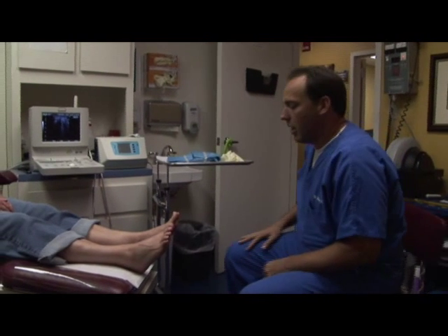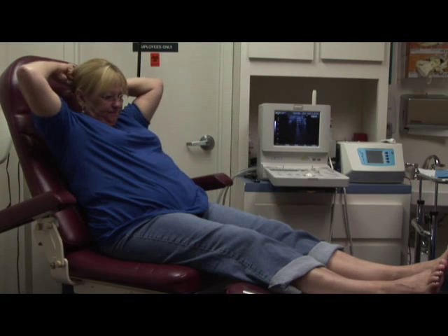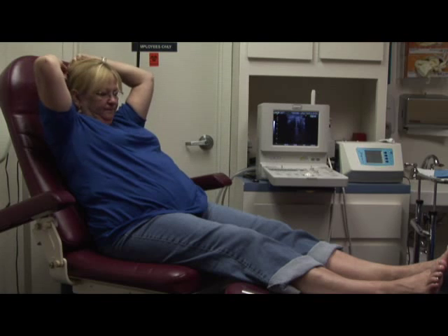The first inner space is going to be used, in this case, because the patient has pain between the first and second toes. This procedure can also be used for any inner space.